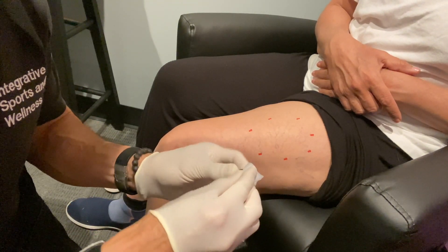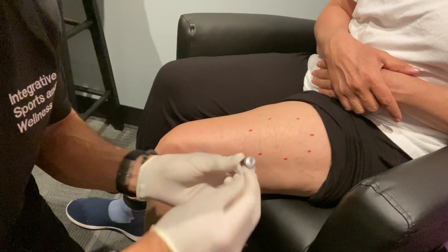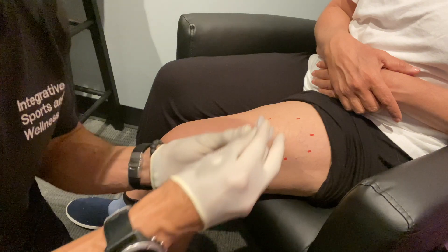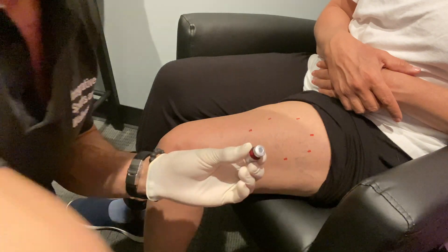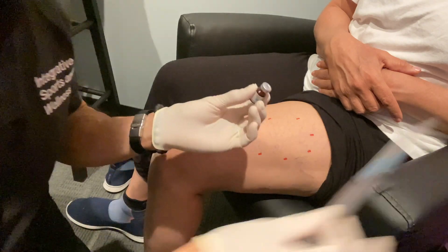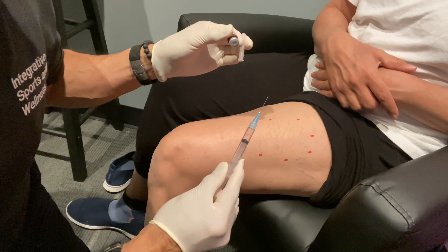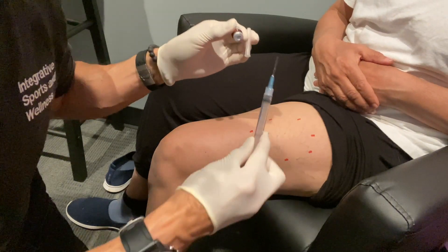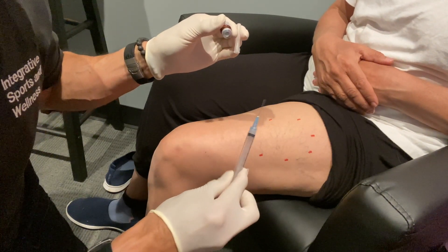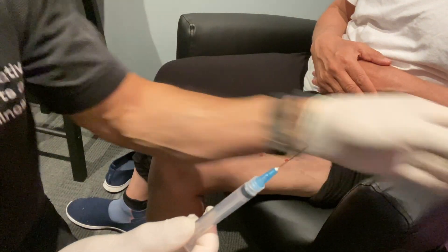You can use the same swab to clean the top of the vial. Theoretically, this should be cleaned already because there was a cap to it, but it's always nicer to have it in a clean, sterile fashion. So we do the same thing as before. This is our needle that comes with the pack. You want to make sure that it has air in it and there's no obstruction to the needle. I put the cap on the side.